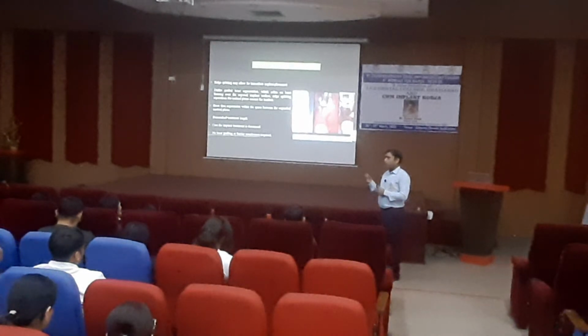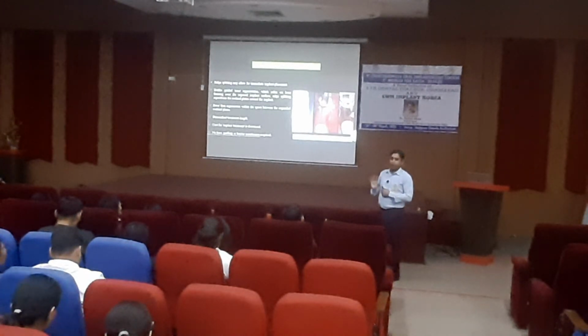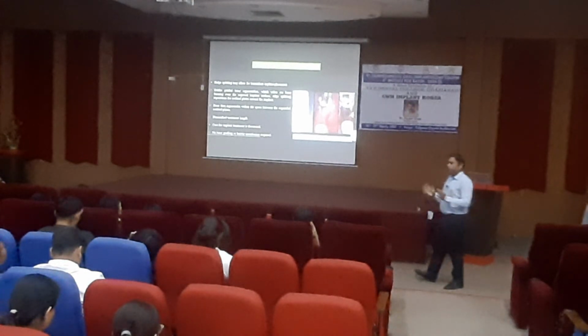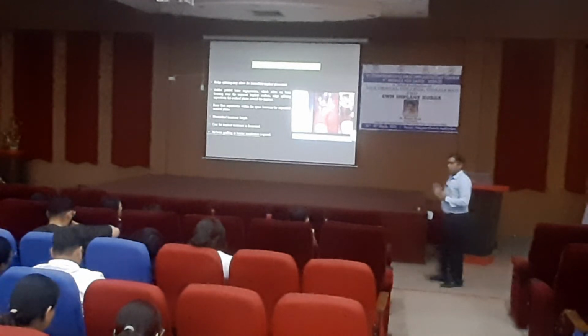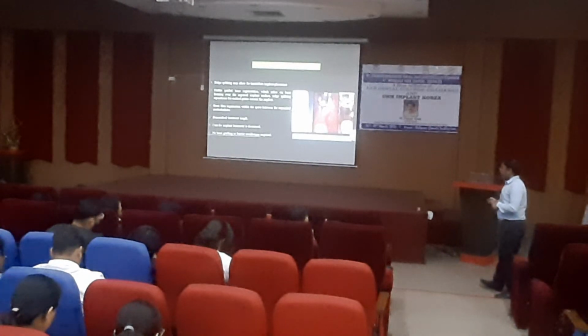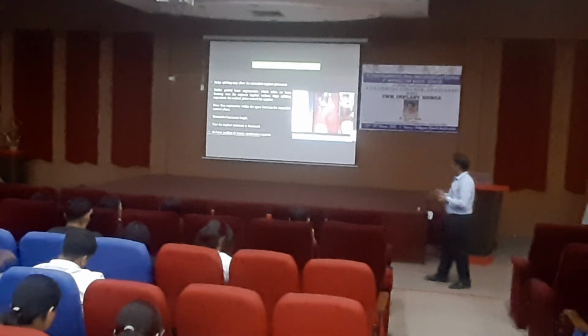Some people also try, once you expand the bone and place an implant, because the jumping distance between the two is more, most people put a graft, but no significant result was found according to the literature. So if you are placing an implant in an expanded bone and not putting any graft, it doesn't matter. The closure should be good and the placement of the implant should be good. Then the cost of patient treatment is decreased because you are not using bone graft or membrane, so automatically the cost is also decreased.